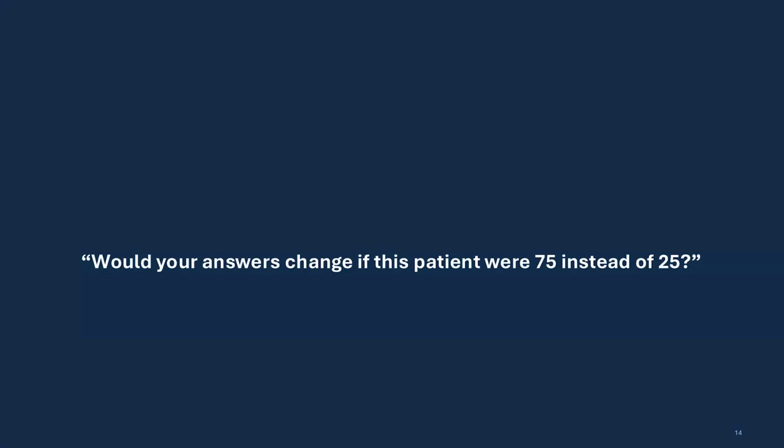But if we talk about adjustable parameters, we will go on. If any patient comes to you, even a very young patient or an old patient, the pacemaker will tell you that the AF occurred at what time, and how many days, hours or minutes the patient had AF. So clinical-wise, you should do rhythm control for her.